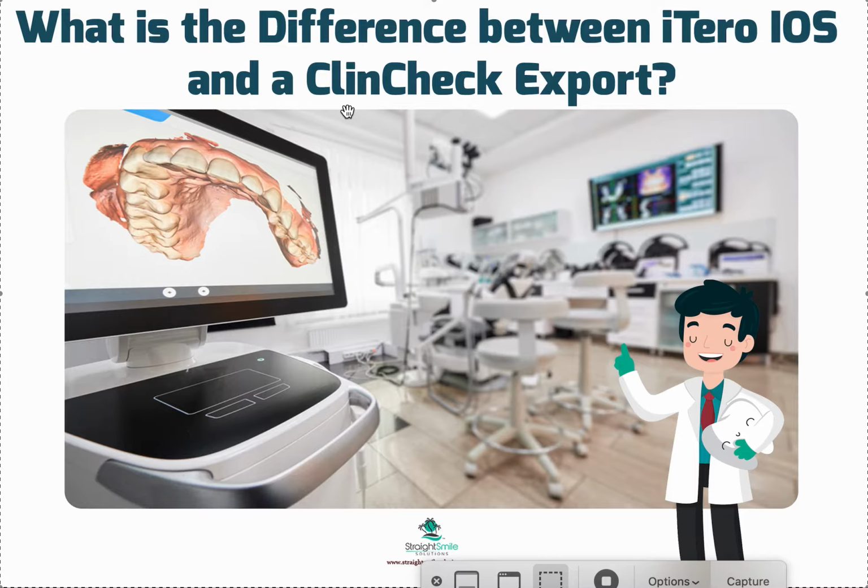Now, most commonly, some doctors will call the patients in, or they will export the ClinCheck to the patient. There are ways that you can send it just through email. It's a bit of a process now. It's changed a lot. So most recently, what will happen is your doctor will put your patient information in, including your email, your phone number, your name. You'll get an alert saying there's a ClinCheck ready for you to view. You will click on it, but you will also have to download an app and put in some personal information and some codes and other things in order to be able to view it. Once you view it, it will not have your name on it because it has to be HIPAA compliant. It'll just be a simulation of your teeth.